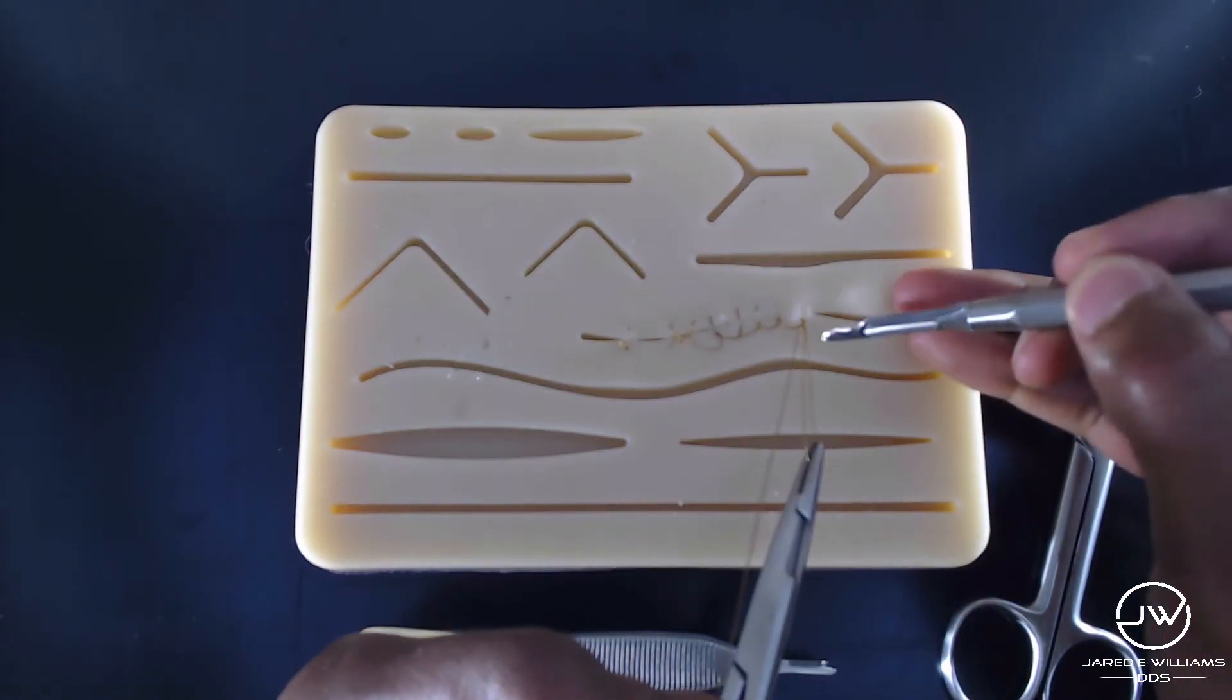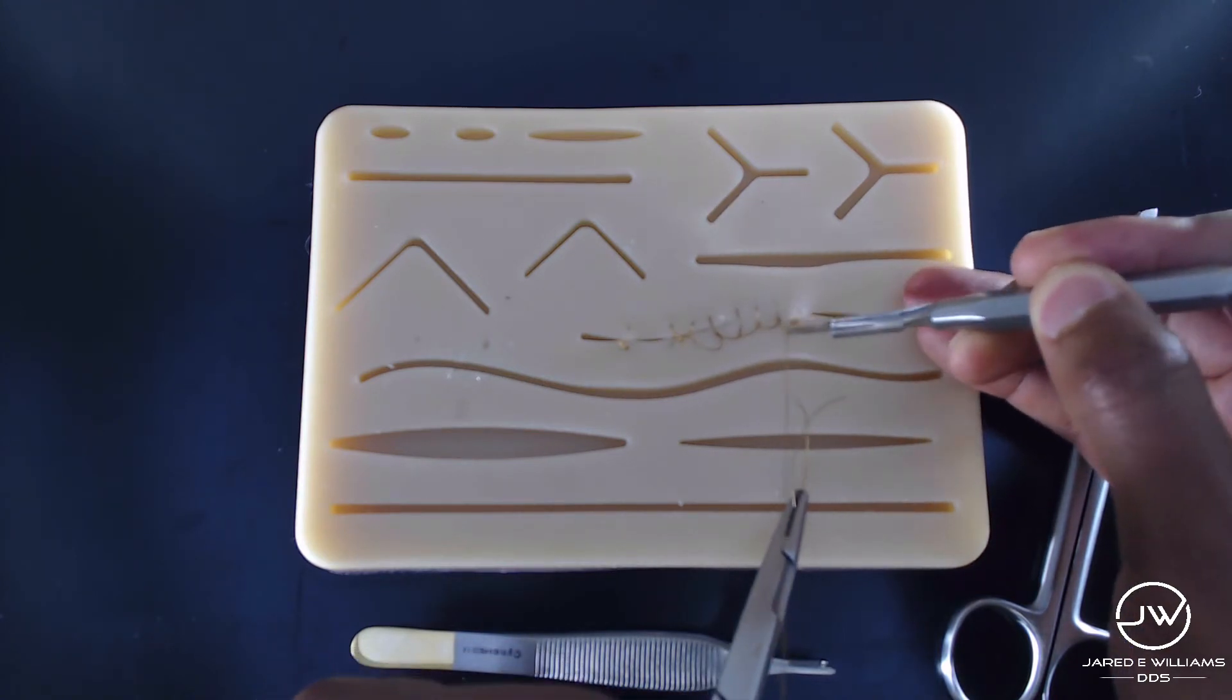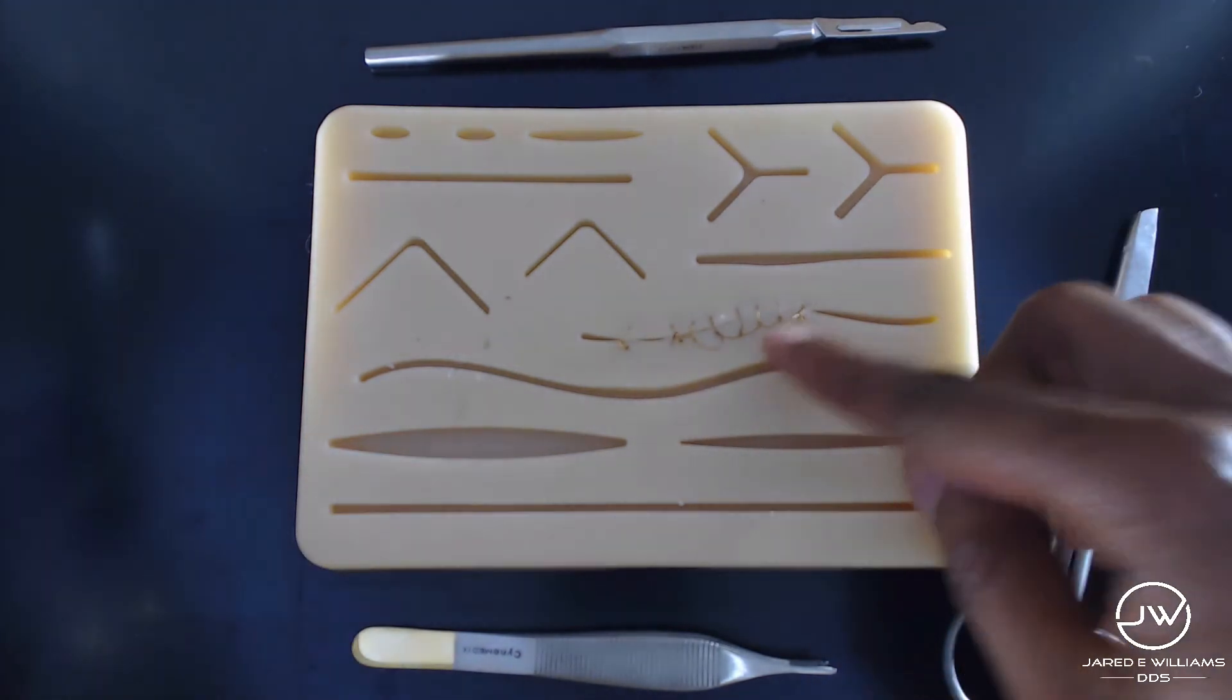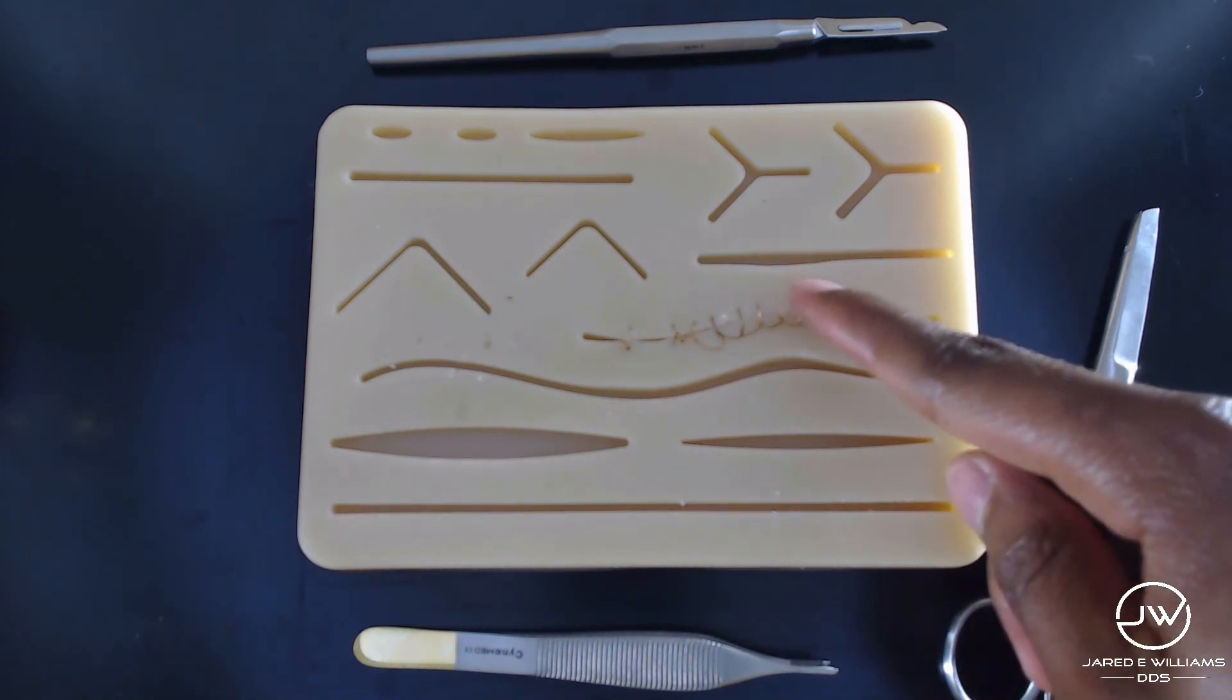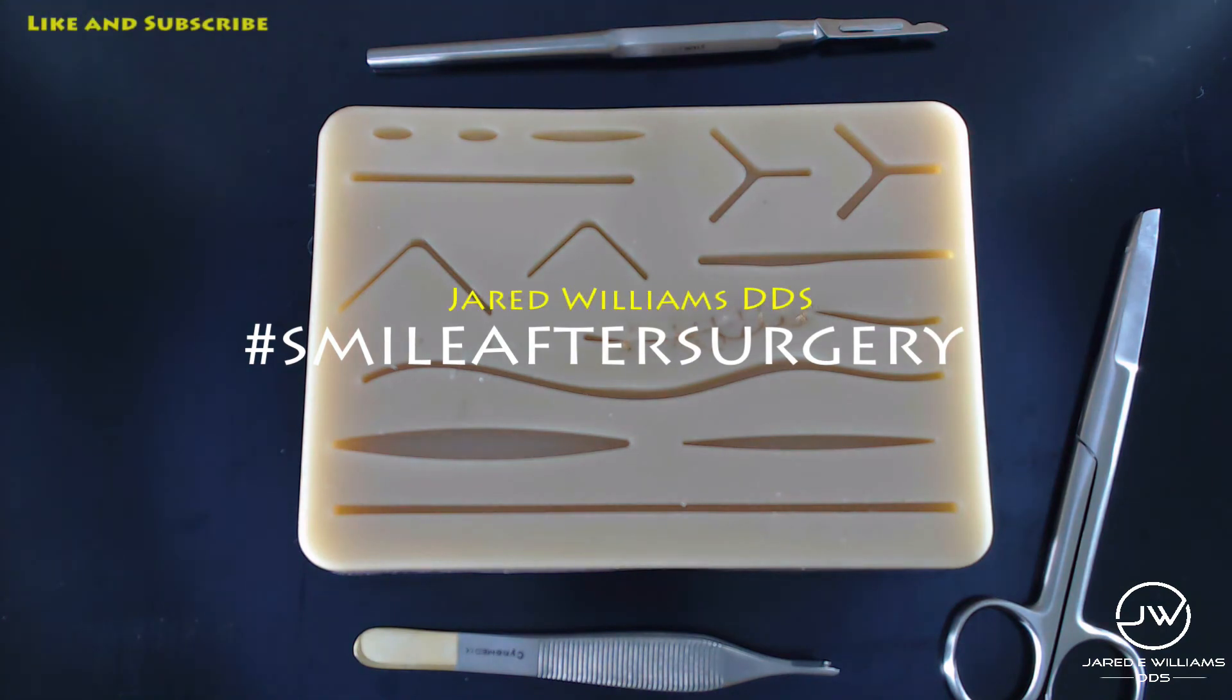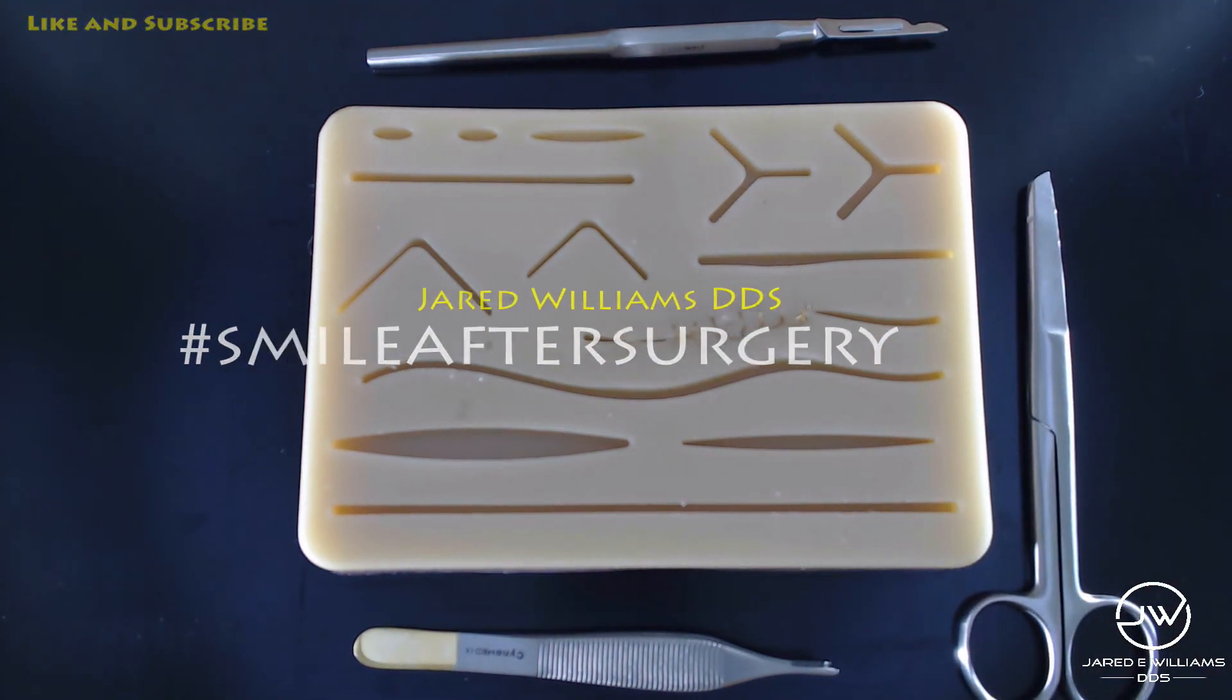Alright, ladies and gentlemen. There goes your continuous suture. It starts off just like your interrupted, and then you just lock it all the way through until you finish. So, there you have it. This is Dr. Jared Williams. And my focus is for you to smile after surgery. Make it a great one.